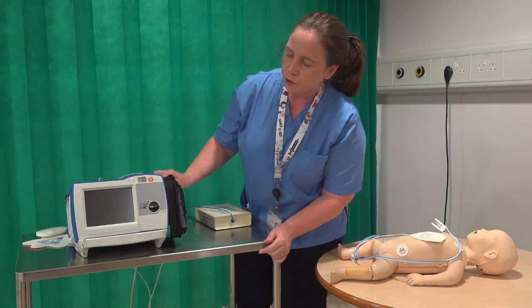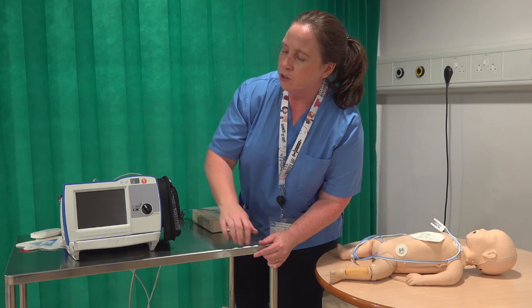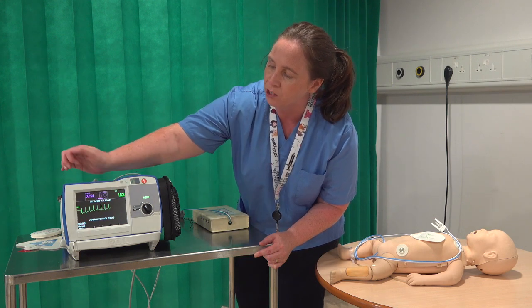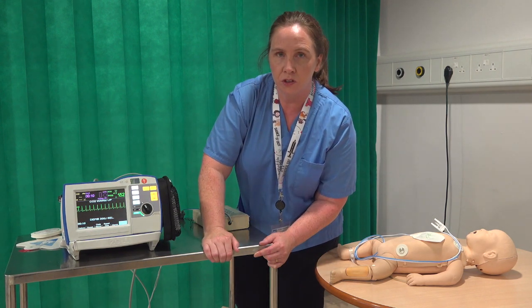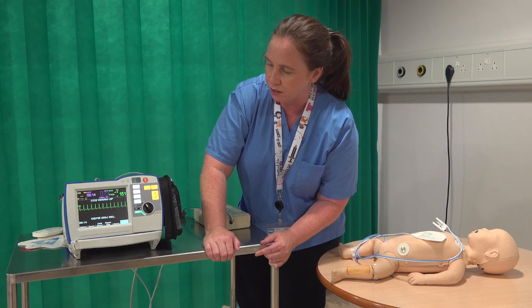Once you've got your pads attached to your neonate, you're going to turn your machine on. The machine defaults automatically to AED mode, so what you need to do quickly is hit the manual mode button on the left hand side, hit the soft key, and that activates the manual functions. We're going to be using it in manual mode for neonates and paediatrics.